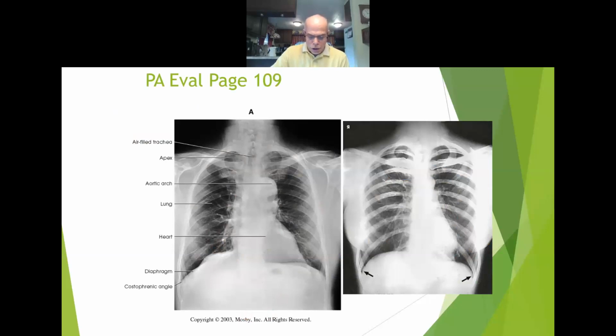Okay. Structure shown. PA projection of the thoracic viscera show the air-filled trachea. Right there, guys. You can barely see it, but I can see it going right there. And there it is again. So there's your carina. Okay, it says the lungs, the diaphragmatic domes. Here's your domes. The heart, here's your aortic arch. There's your heart. If enlarged laterally, the thyroid or thymus gland, not going to really see that because that's going to be higher up in the neck, but if it's enlarged, you probably could.